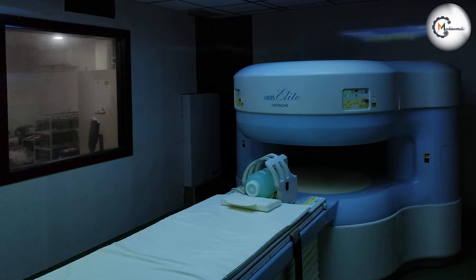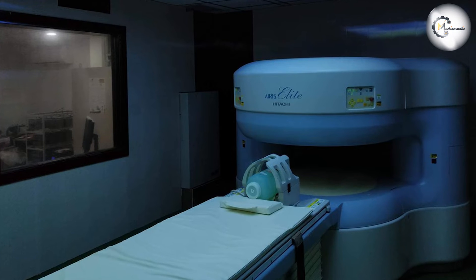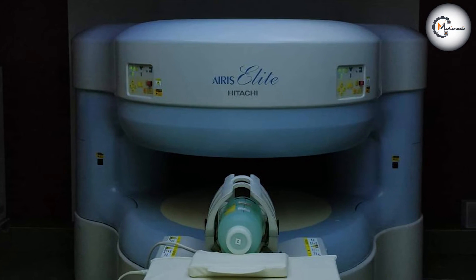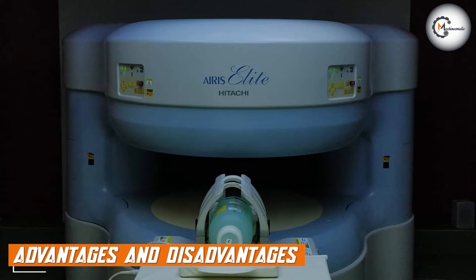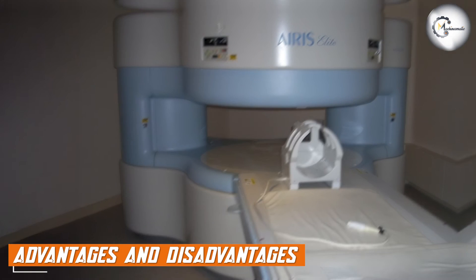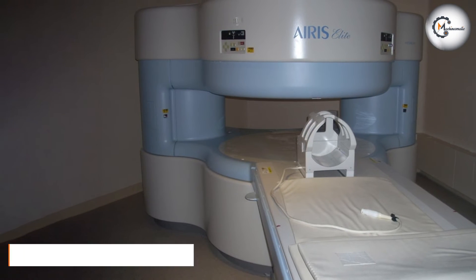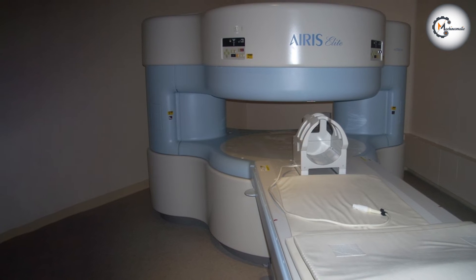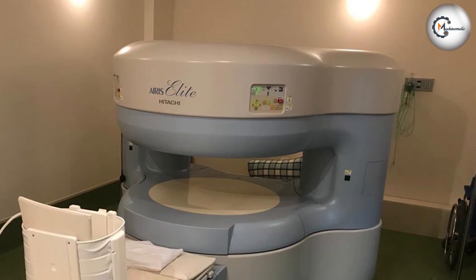Another notable feature of the Ares Elite 0.3T is its user-friendly interface. The system is operated via a touchscreen panel, which makes it easy for technologists to navigate through the imaging protocols. The machine also has a variety of imaging options, including T1 and T2 weighted imaging, gradient echo imaging, and fat suppression imaging.